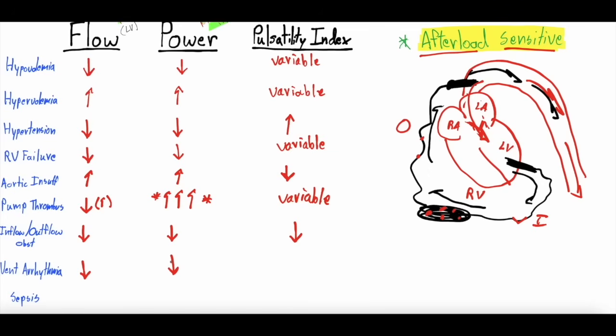What about the pulsatility index, right? Start thinking about this one. If you're not getting a lot of concentric contractility, squeeze of the left ventricle, some people equate pulsatility index to the contractility, how well the ventricle is able to squeeze. If it's in ventricular tachycardia, it's not going to be squeezing very well. Pulsatility index is low.